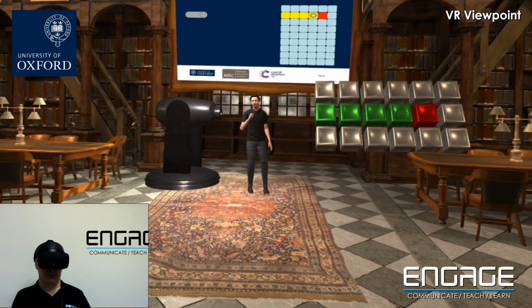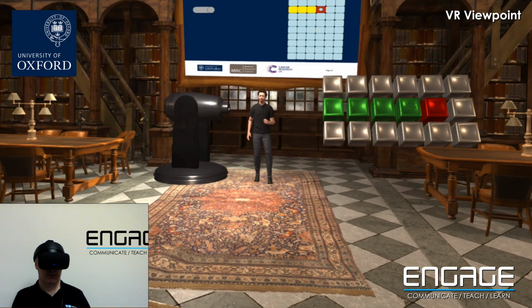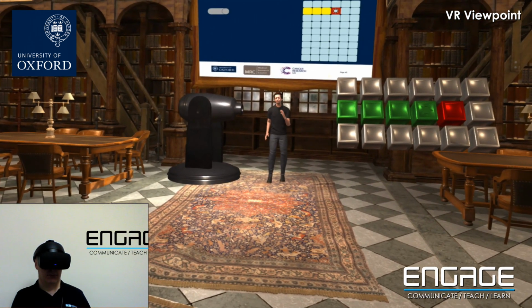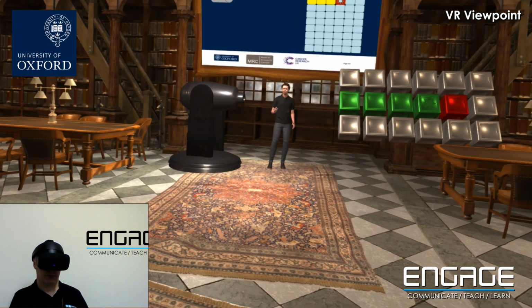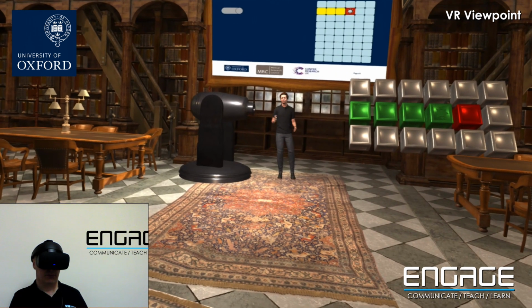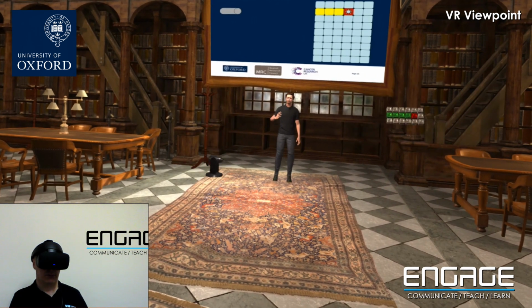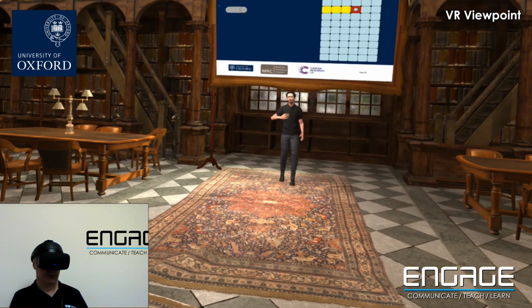I need to image, and my imaging, my understanding of where the tumor is really has to be spot on, and it has to be spot on for each and every patient, every time. And of course, people move. And they move as they breathe. So any tumor that's within the main cavity of the body is potentially moving as the patient breathes.